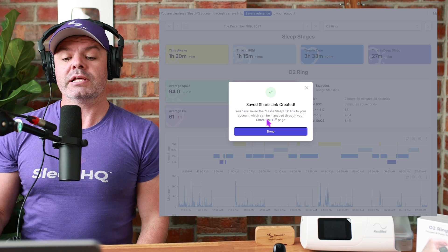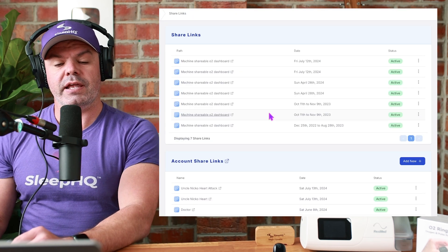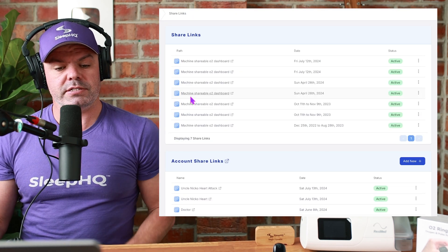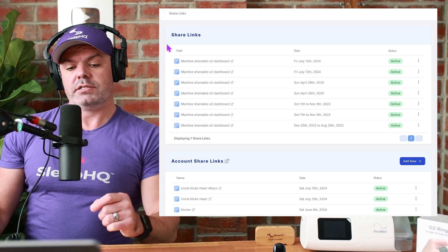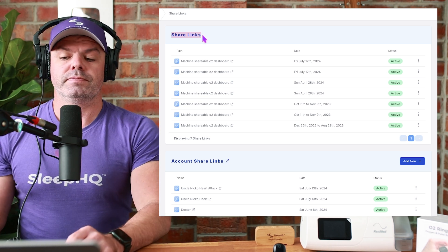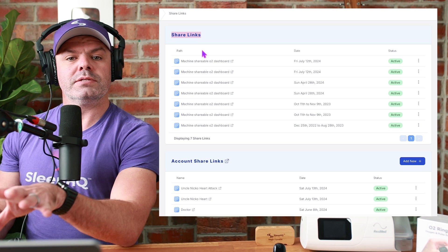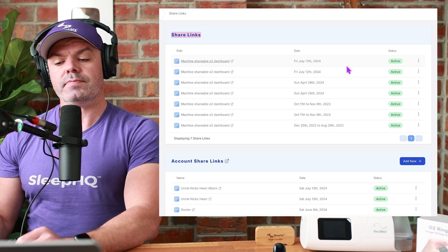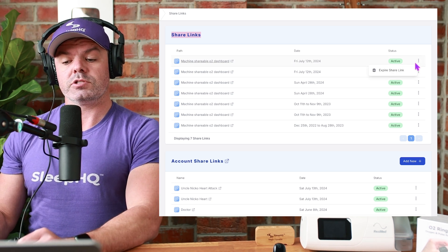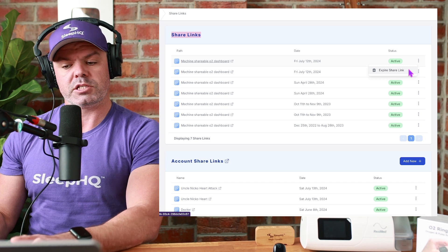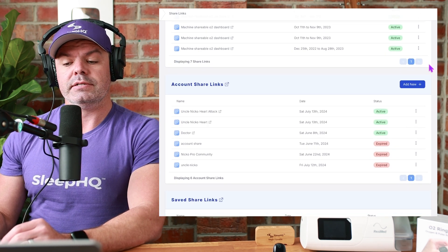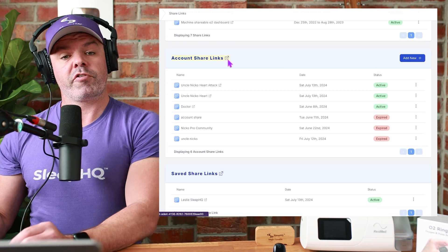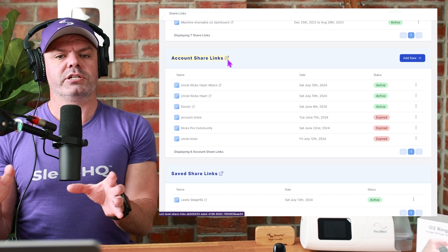And here's all the share links. It's over here as well if you want to find it. Share links. So these share links here at the top are like my daily view ones, my zoomed in ones. I can delete them at any time. So I have full control over the share links. I can expire them. If I come down here, here are the account share links I've created. So you can create multiple account share links.